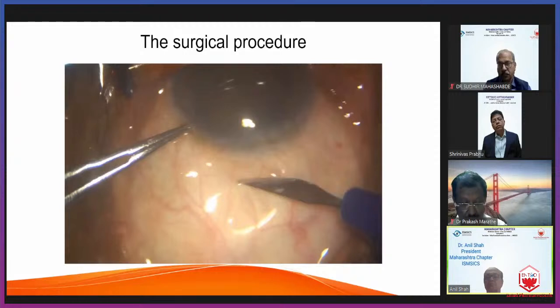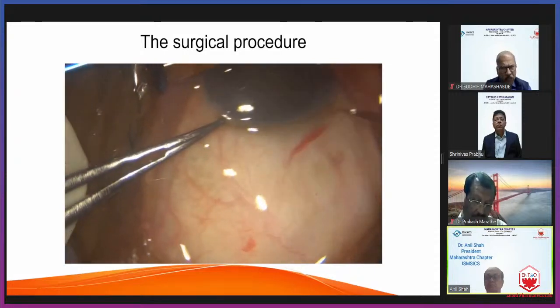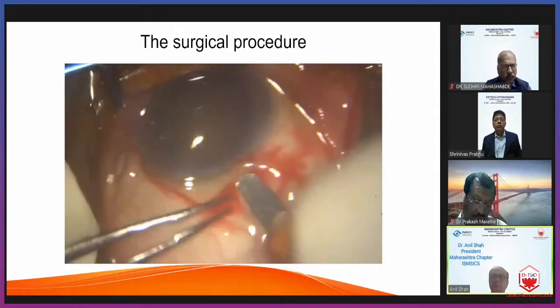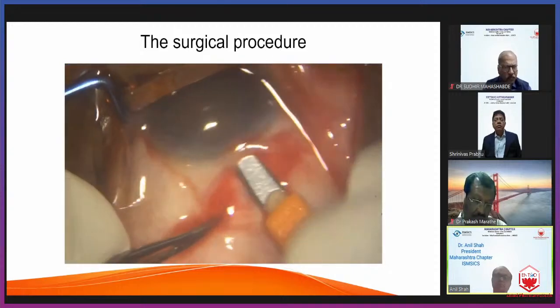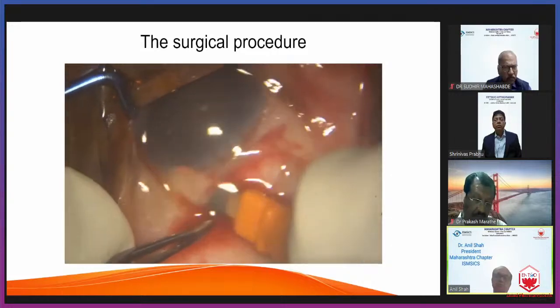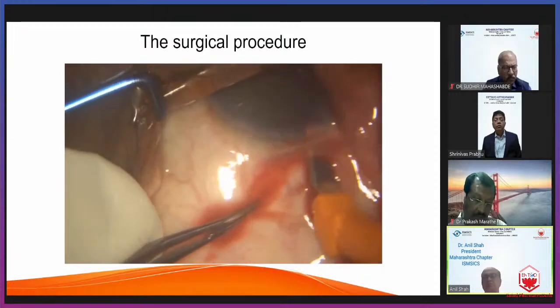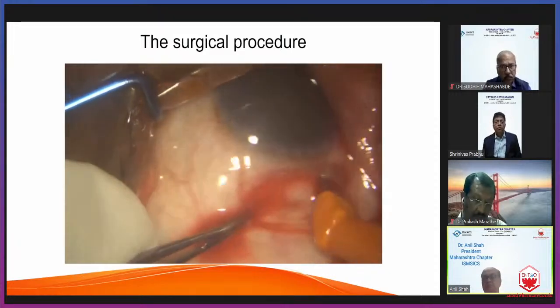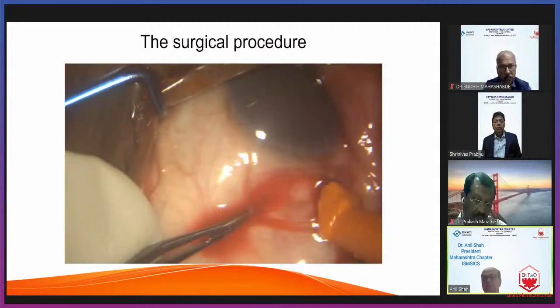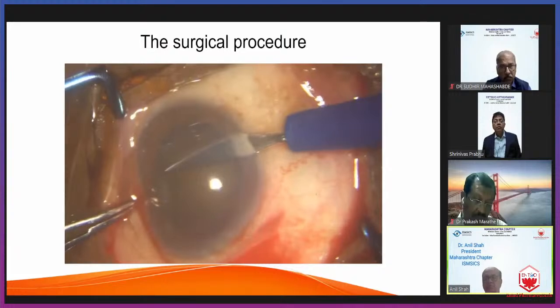And the surgical procedure. I'm using a side port knife to go through the conjunctiva, make my initial incision. I don't have a bridal suture in place, and that can pose a problem. And I'm dissecting out my scleral tunnel by feel. So it's about one-third to half thickness, and you can do it. And your assistant has to initially irrigate that area to wash away the blood.